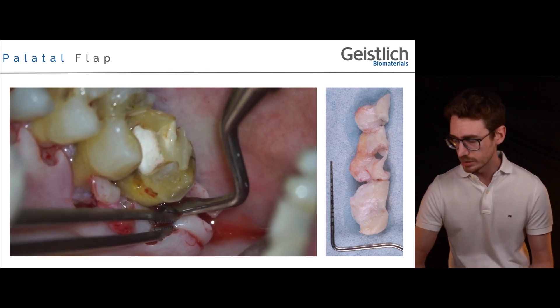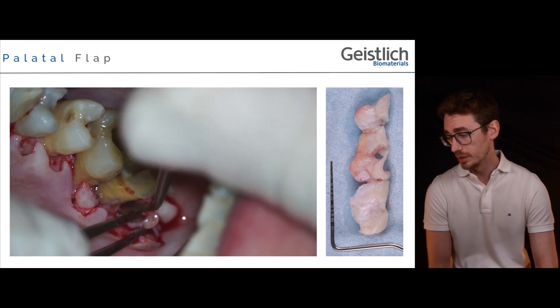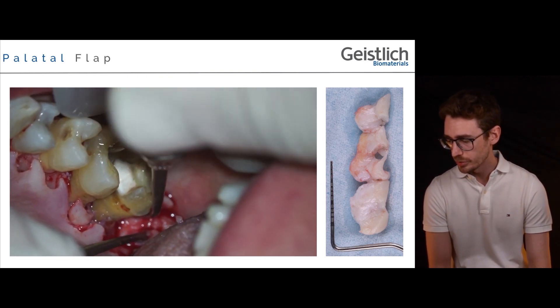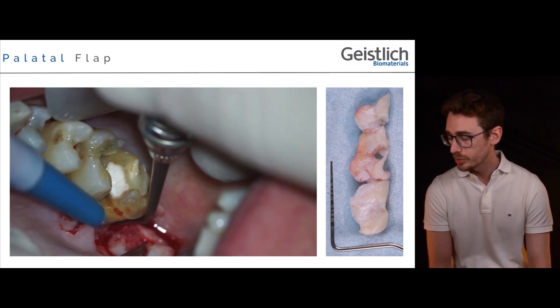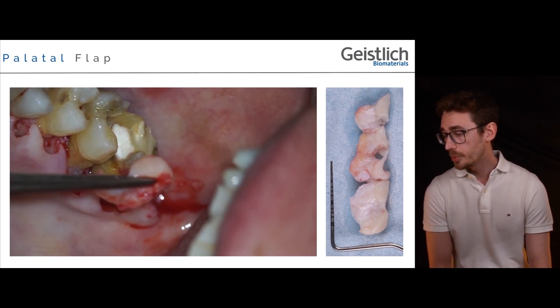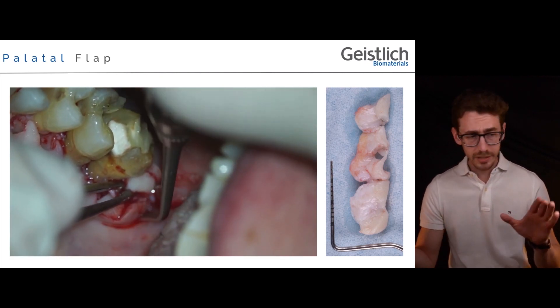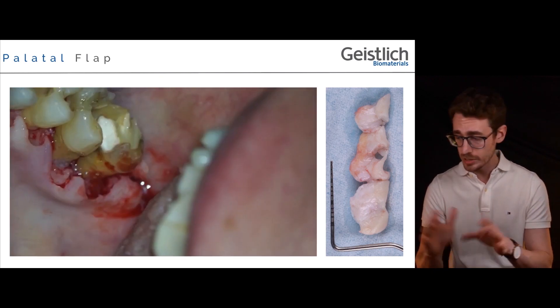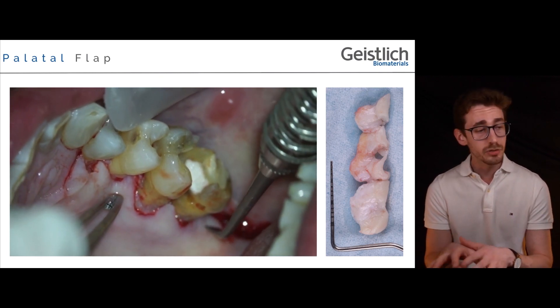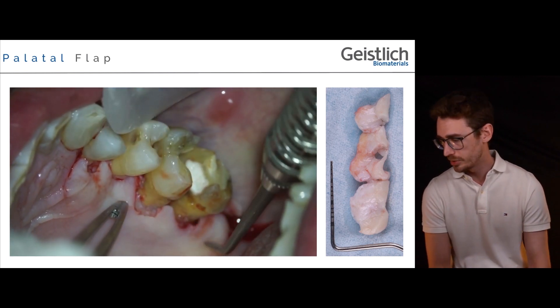We continue removing the distal wedge to achieve the plane of the alveolar bone, liberating the periosteal insertions of our distal wedge. Once the distal wedge has been removed, we can appreciate the amount of tissue removed, and we can see that our buccal and palatal aspects of the wedge immediately close by first intention in a more apical position, with the thin palatal flap adapting at the alveolar crest before the osteosurgery.